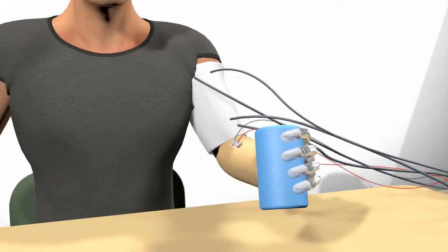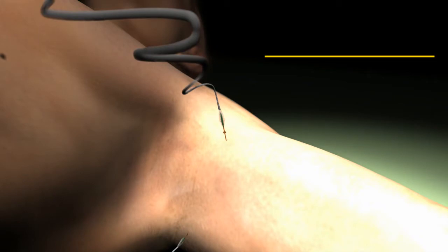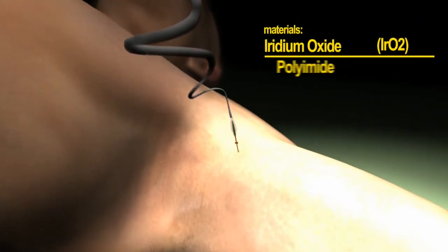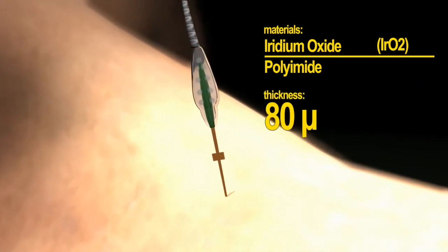It could sense some geometric properties of shape, such as the curvature of a baseball or the cylinder that is a water bottle. It could use the restored tactile information to apply the appropriate grasp and handle different objects without watching.